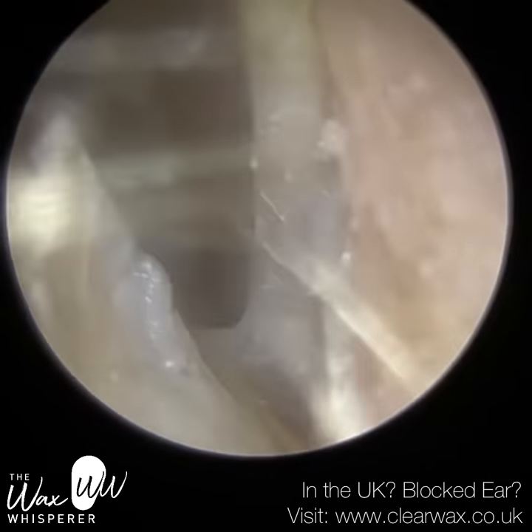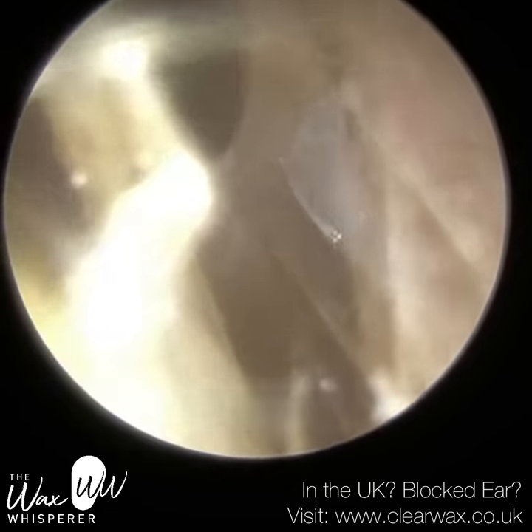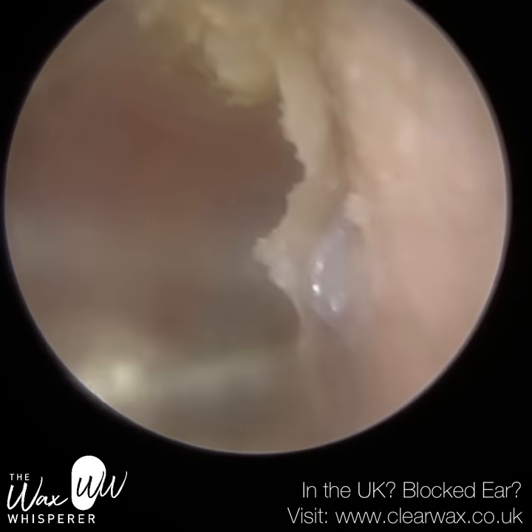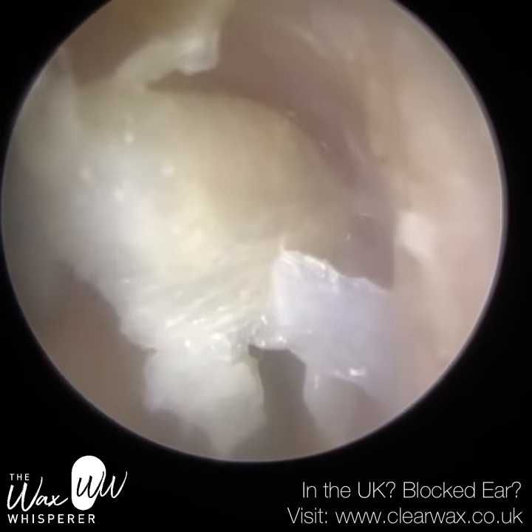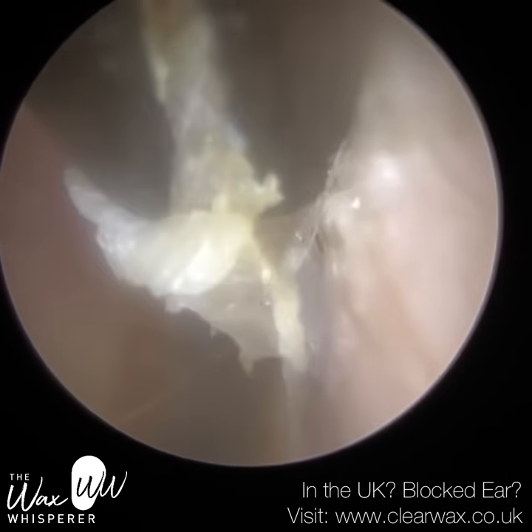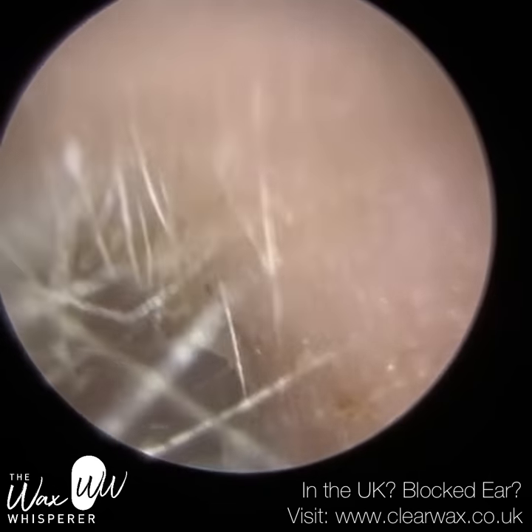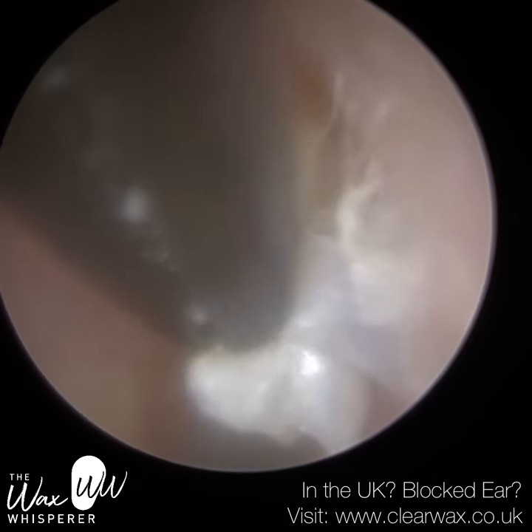Just using the forceps again, I'm going to get a good grip on the anterior canal wall. This skin is really thick, and I'm just wriggling the forceps to try to detach the skin. I've got a reasonable-sized sheet of skin out there. The skin is almost like wallpaper that you're trying to remove, but it's strongly attached to the wall. That's why I've used a bit of oil — just to soften the skin a little and break down that bond, that adhesiveness.